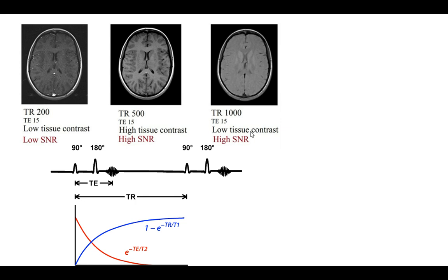Why would that be? Okay, so part of this has to do with there being a peak on these. The TR on this is not just when the next pulse happens, but when I can do my flip inverts and all the rest of it for the T1s. So when you're looking at that distance, it's how far out it can spread when I do the measurement.